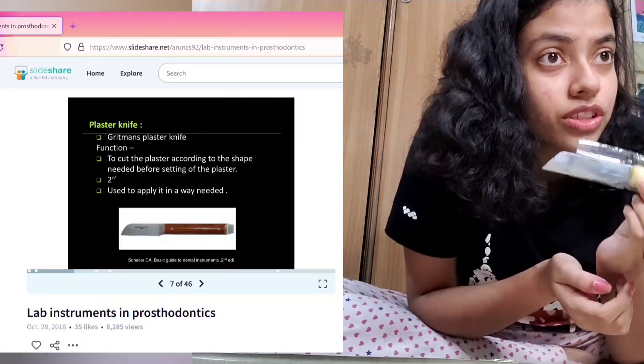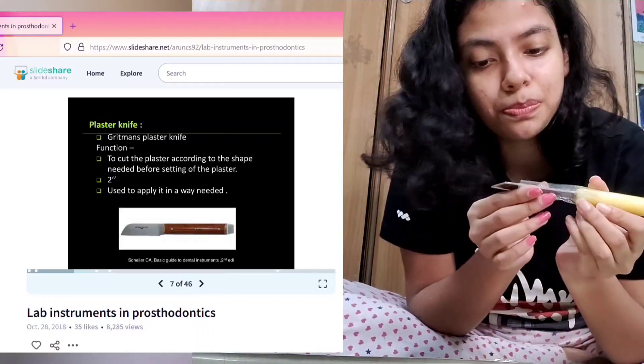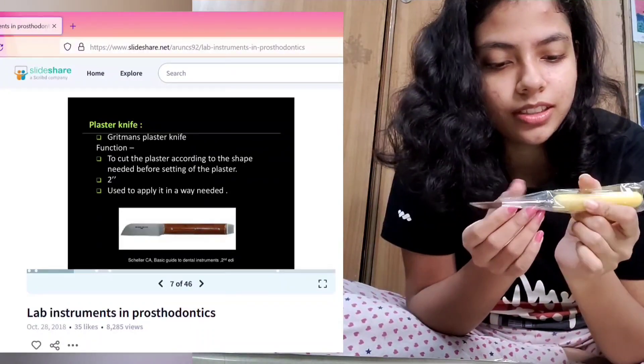This is called a plaster knife. It's used to cut the plaster according to the shape needed before setting of the plaster. It's pretty sharp.